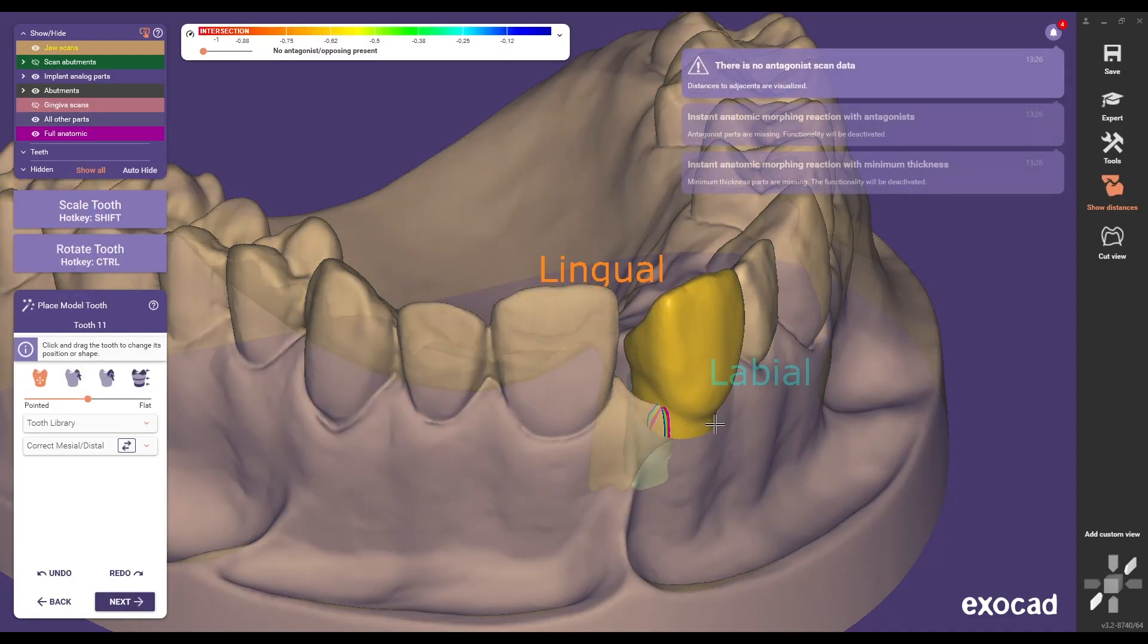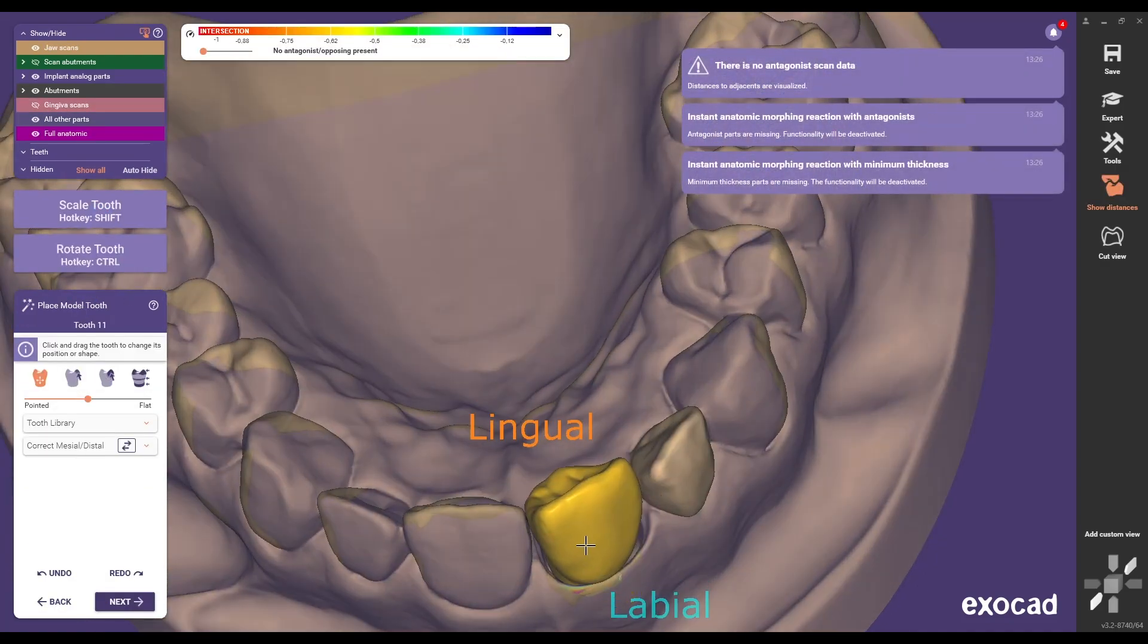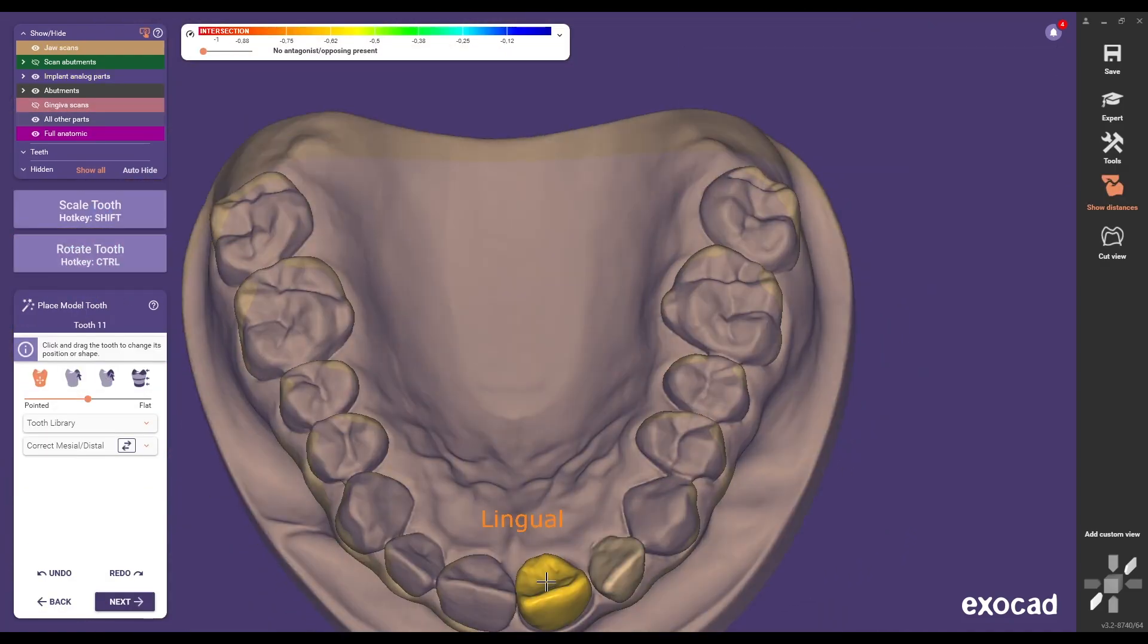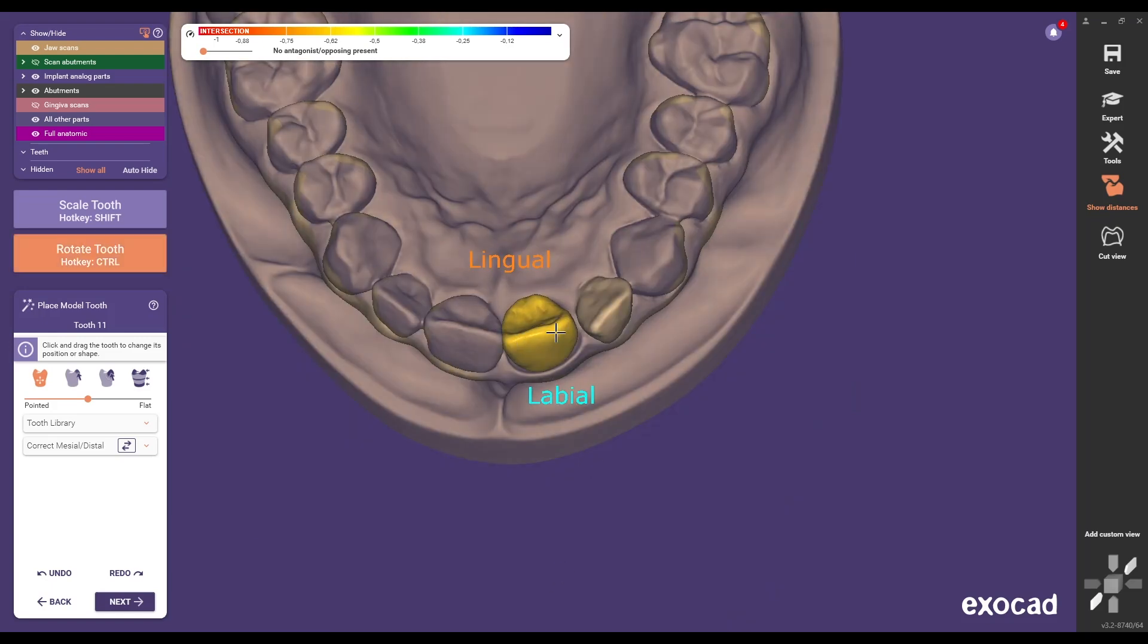Proceed with the usual design steps according to dental technical requirements up to the abutment bottom step.